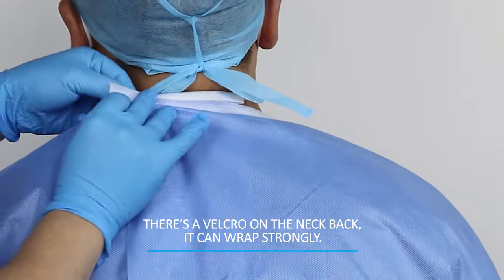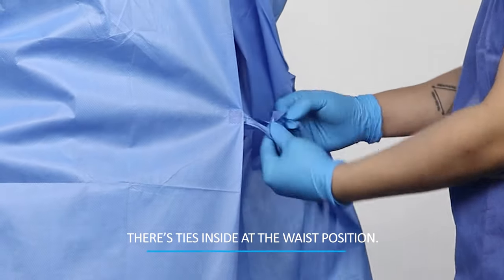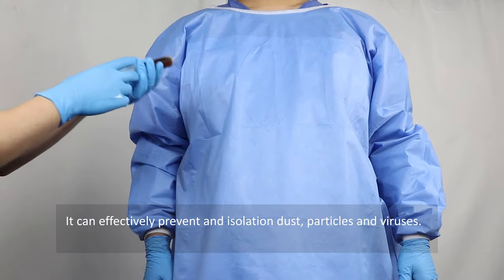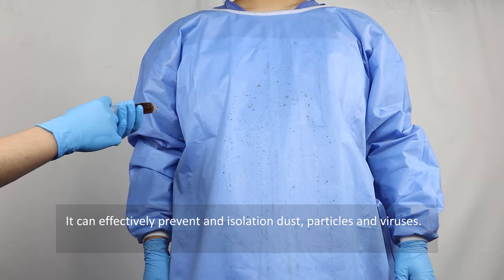There's a velcro on the neck back — it can wrap strongly. There's also a tie inside at the waist position, which can effectively prevent and isolate dust particles.